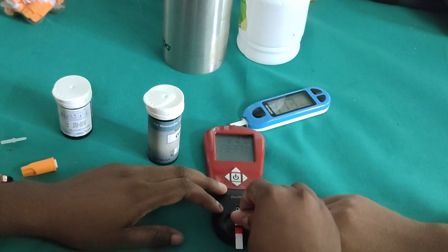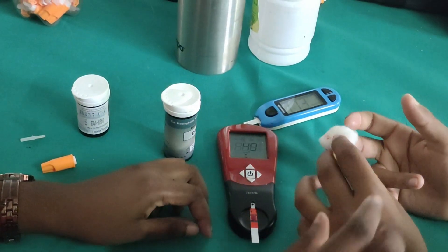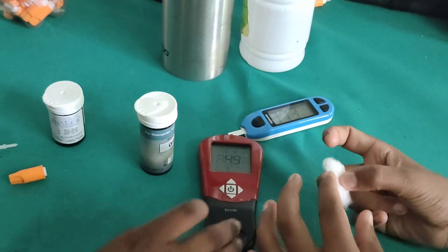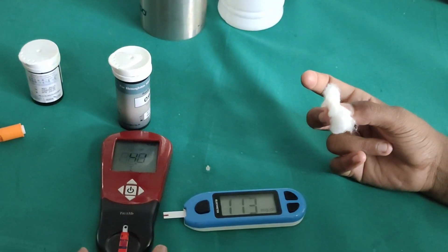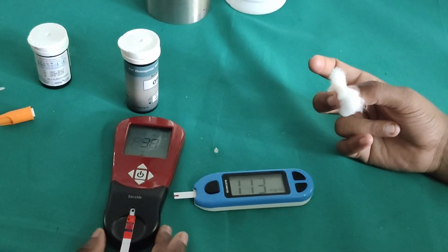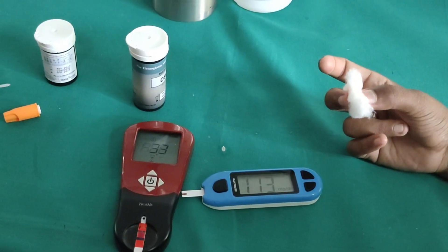The droplet should cover the testing area. We have already got the RBS result. The HB will take a whole minute for the result, so we have to wait until the minute is up.